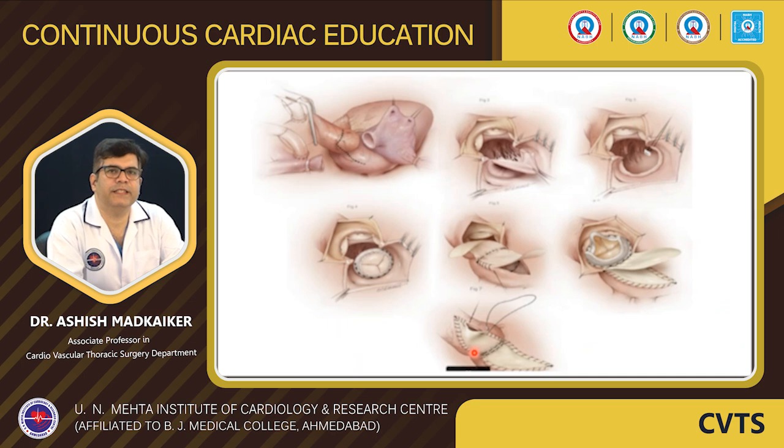So one of the challenging situation in infective endocarditis, which we will quickly go through, is when it involves aortomitral curtain, or when the infective endocarditis involve both the valves. So doing AVR in this situation is also very challenging. So it is better to do bicaval cannulation in infective endocarditis situation, because we don't know what we are going to expect once we open the heart. So it is safe to do bicaval cannulation, loop and snare, both SVC, IVC.